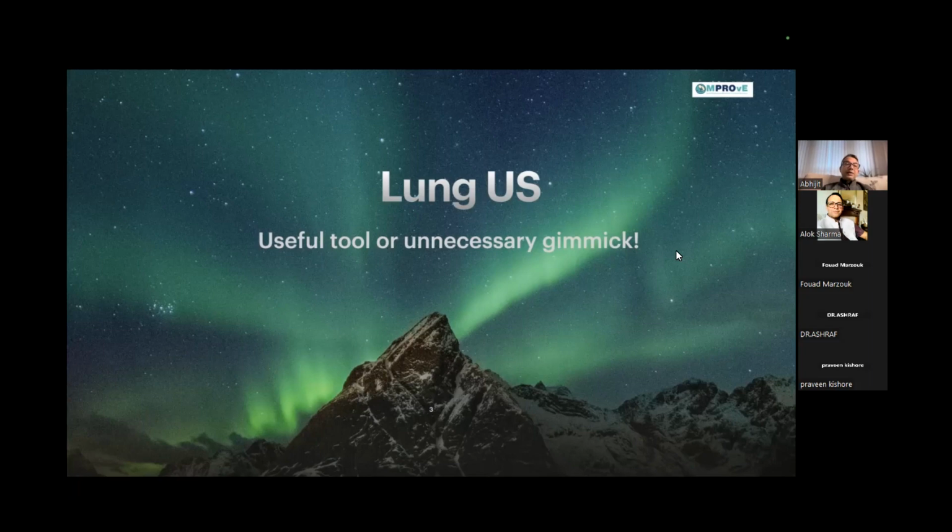There's no dearth of evidence now. There's a plethora of evidence in the literature saying that lung ultrasound is quite superior in diagnosing, be it TTN, RDS, pneumothorax, pneumonia, and whatnot. So yes, this is a useful tool, and this is not an unnecessary gimmick. It gives us much more information to tailor our treatment for the babies. So it is better than a chest X-ray.